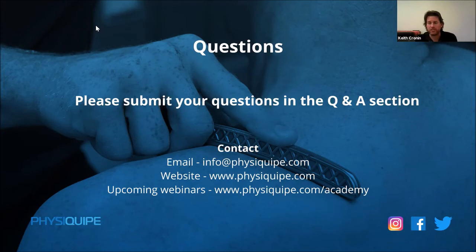So my recommendation is you always start out a little bit lighter just so you can see what their response is. If they're very fair skinned, they're more likely to have a bit more of a reddening response. We don't want to see those little dots showing up in the skin. That means you're breaking the capillaries and you've probably gone a little bit too far. There is a bit of a difference between Western and Eastern thought, and part of it from an Eastern thought is that if you cause a significant amount of tissue damage, it draws the healing elements to the area.